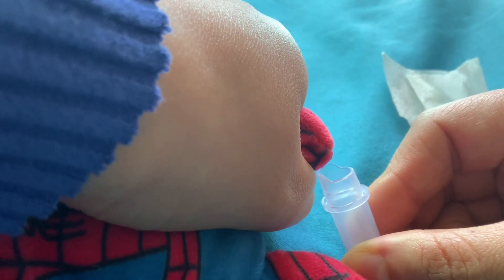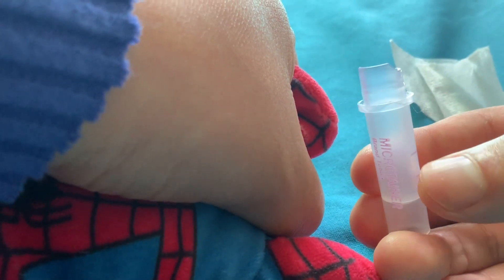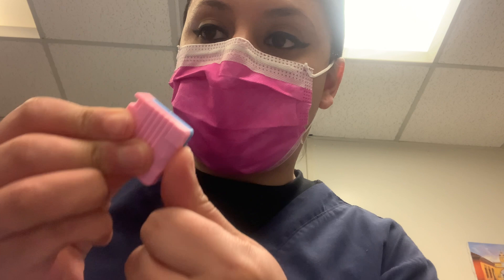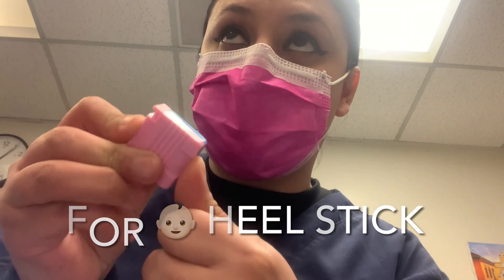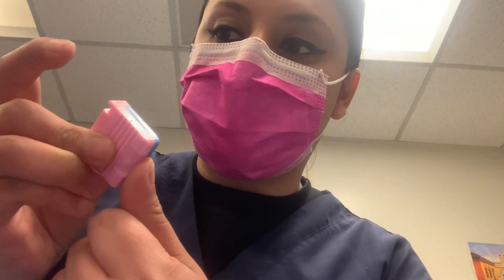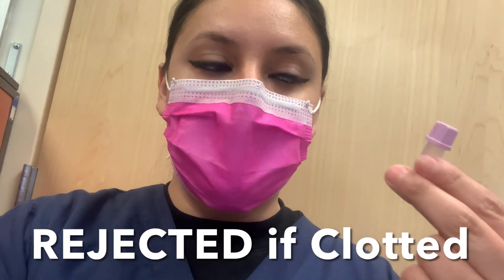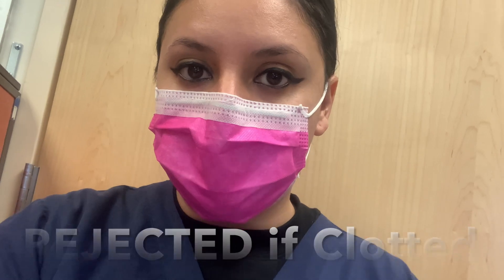Big drops keep going and you'll see it's working. Before you poke, apply pressure — press down as much as you can before you click. So poke with very good pressure and you'll get a good flow. Always wipe the first drop. Once you're done with that tube, then you move on to your SST or your green top.